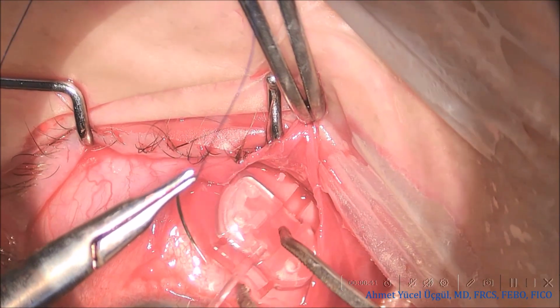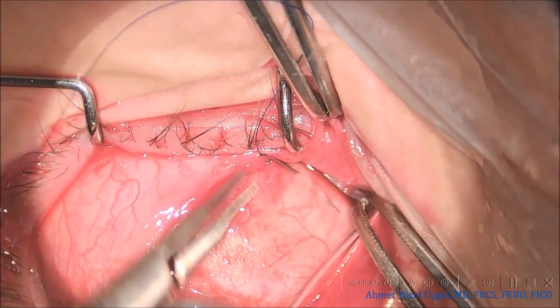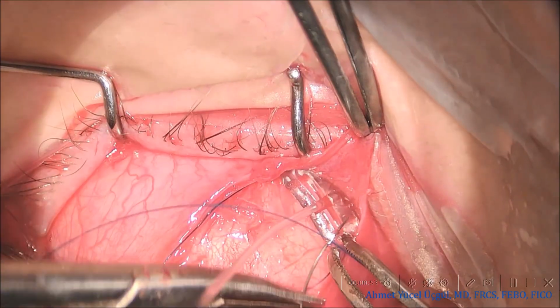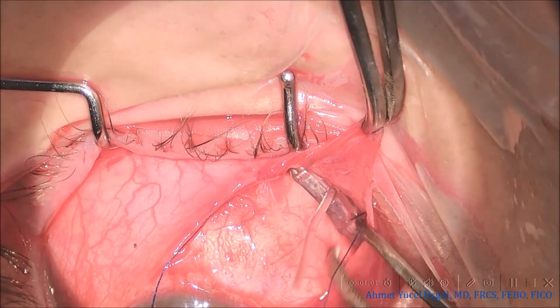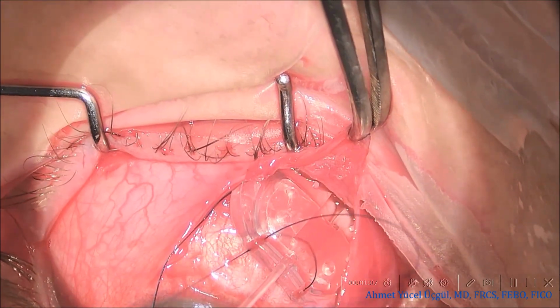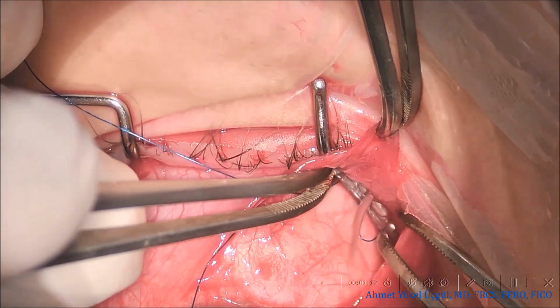Here again, I fix the Ahmed Glaucoma Valve plate 12 mm posterior to the limbus using a 6-0 Prolene horizontal mattress suture. I prefer this more posterior fixation in order to encourage aqueous outflow not only into the conventional periplate reservoir but also toward the posterior orbital space. I also favor Prolene over Vicryl for its greater long-term stability, helping to minimize later plate movement.